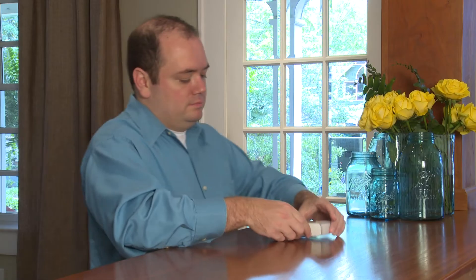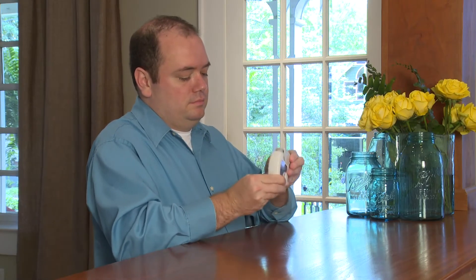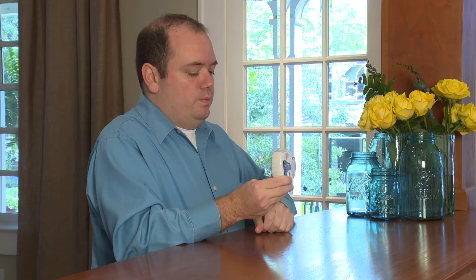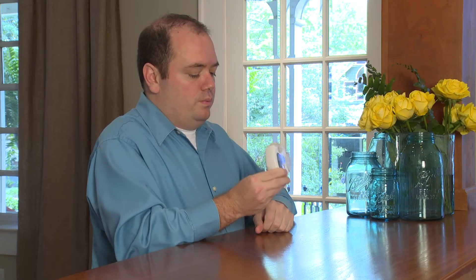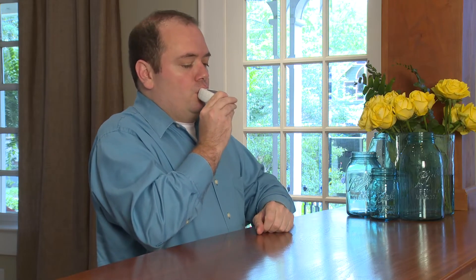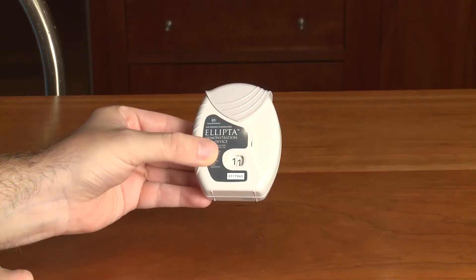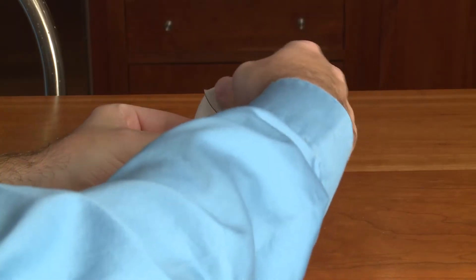Many people have trouble breathing and need to take medicine to help them breathe better. Medicine for your lungs can be taken many ways. One way is by using an Ellipta dry powder inhaler. With an Ellipta, you take medicine in the powder form — you have to breathe in the dry powder medicine using the Ellipta. This video will show you how to use your Ellipta the right way.